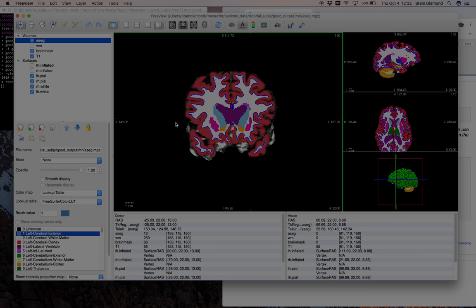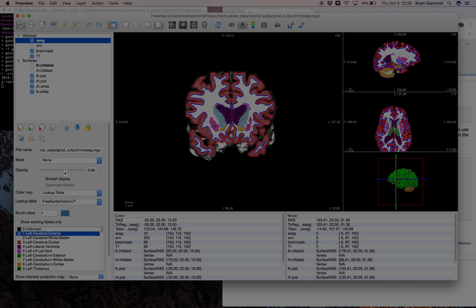In the control panel below the toolbar, you get general parameters for the current active volume. You can modify things like opacity, render mode, and color map — grayscale, segmentation, or heat maps. For instance, if we change the opacity of the ASEG, we see more and more of the rendered volume underneath, which in this case is the brain mask.